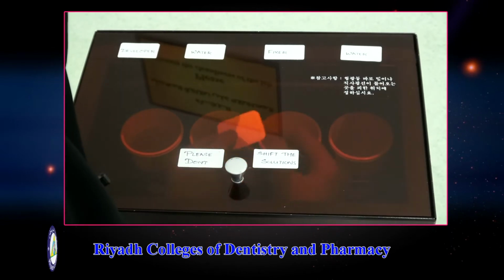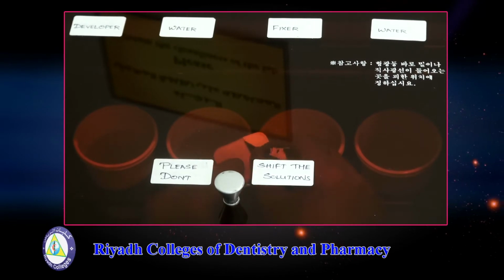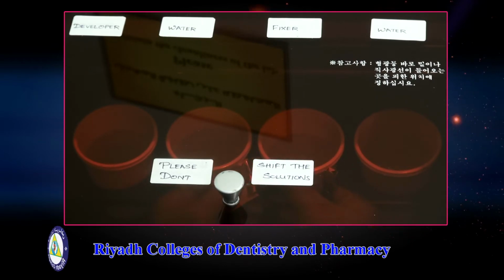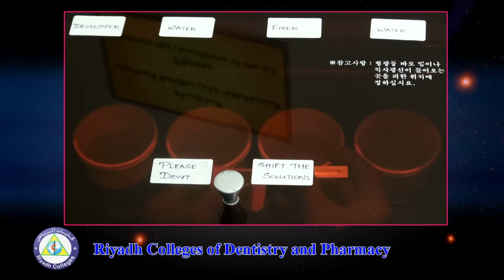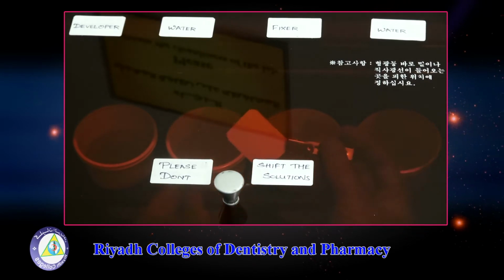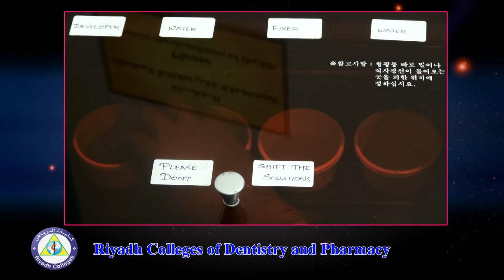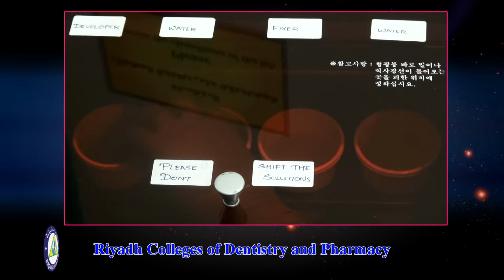So always remember that the clip should be held on to the occlusal dot. Now we are reflecting and opening the film packet. Reflect the black paper, reflect your lead foil, and you have to take out your film. You have to pull out the film with the help of your film holder. Now the thing that you are going to do is first put the film inside the developer. You have to wait for some time till some images are appearing on the film.